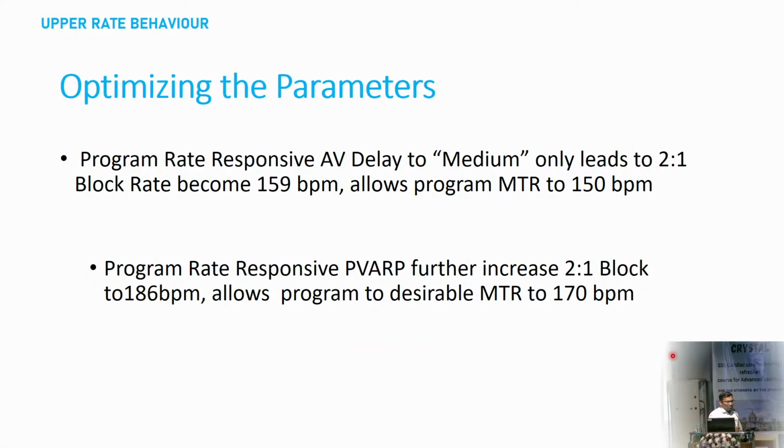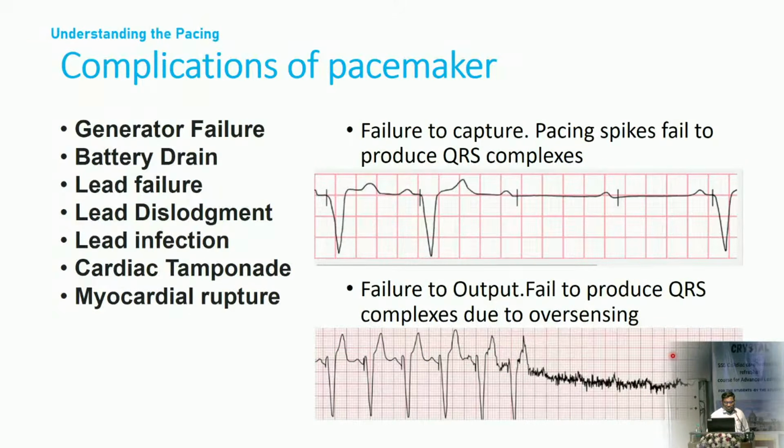Certain parameters we can understand by looking at them practically. If you go and program the devices, you will understand what set of parameters it will allow you to program, and you need to understand the TARP and all those other parameters. Of course this is important. I'm just touching the topic, where it can be programmed and taken care of in terms of programming. I'm not going in depth.